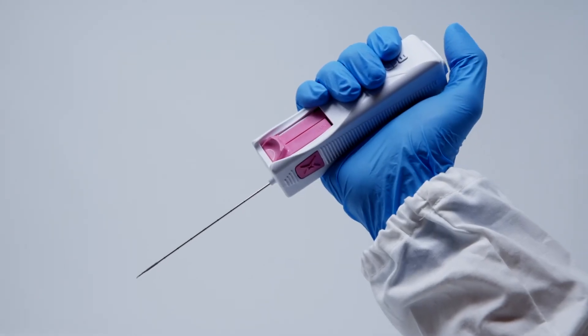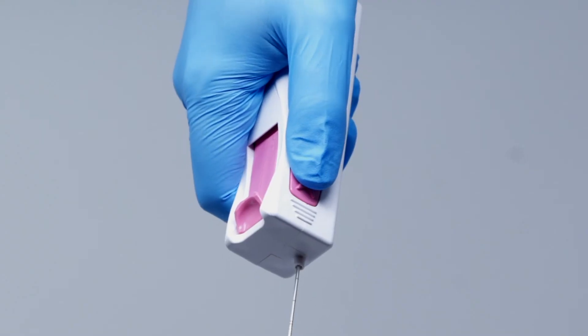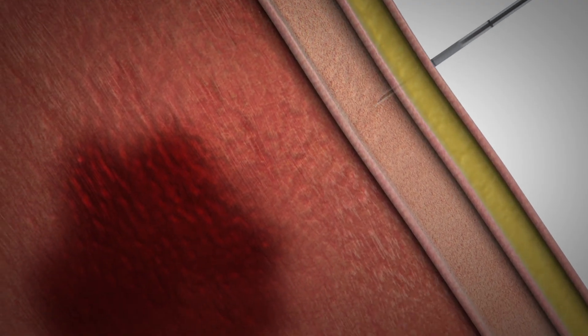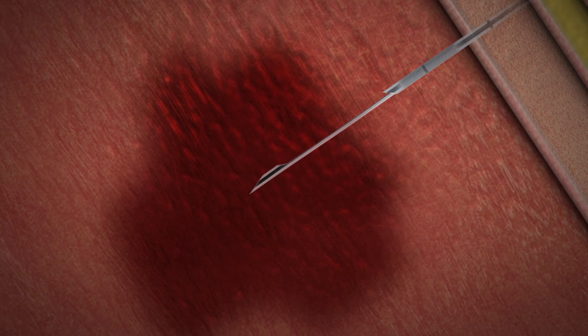Two firing buttons can accommodate your preference. Select either the side or the rear one. Insert the tip of the needle to the point to be biopsied.